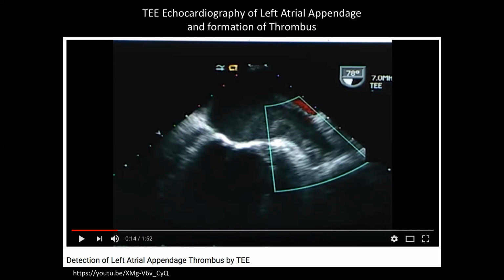And hope you don't see it, as you're just getting it off the wall, and go, that's not good, right? In fact, they have some devices that you place distal, downstream. You can put a little mesh in a large vessel, such that if anything breaks off, it'll get caught by this mesh. And then, just like a fisherman, you get that net out at the end of the procedure.